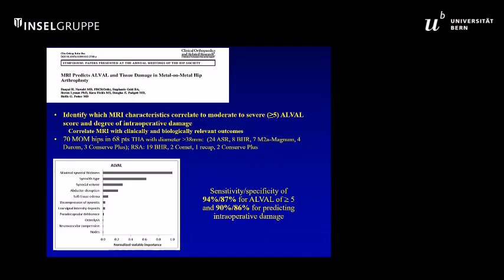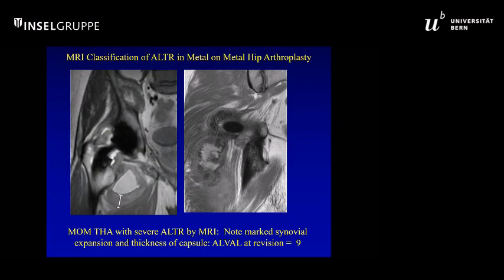Then we asked, when all these adverse tissue reactions came up, of all the things I can think about, what will rise to the top as correlating with histology and the prevalence of ALVAL histologic scores? And in fact, it was synovial thickness. So an adverse tissue reaction is not just a thin-walled fluid collection, but rather a thick-walled fluid collection, as you can see in this particular patient, with that very thick synovial lining, not just the presence of fluid.